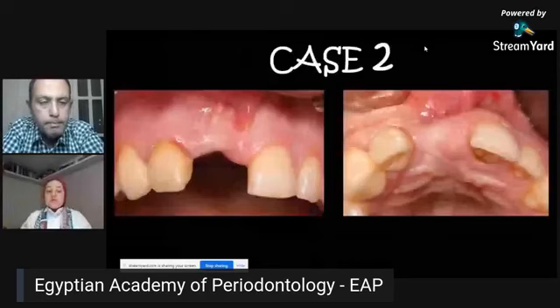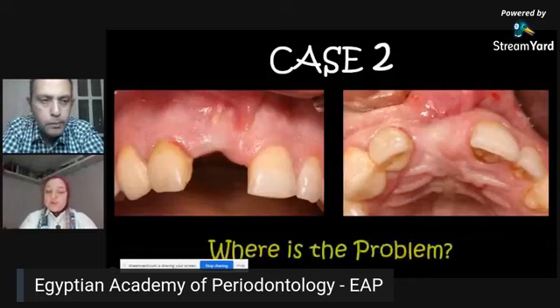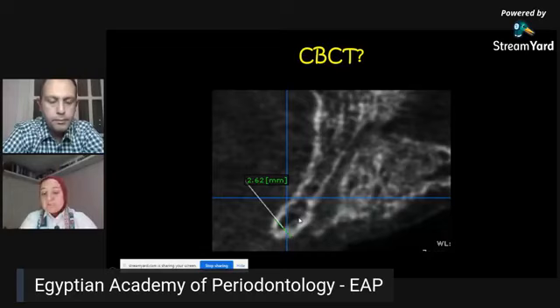So the second case we're going to discuss is a case that, again, if you look clinically, it may be looking fine. You don't have that huge buccal depression labially, so maybe things look okay. But then when you go for a cone beam, you find that you don't have enough bone at all. You only have almost 2.5 millimeters of bone. Because this is an upper anterior area, we are now thinking about the cortical plate. It's a very thin cortical plate and enough spongy bone. But still, this is not enough for splitting or expansion because you only have 2.5 millimeters.